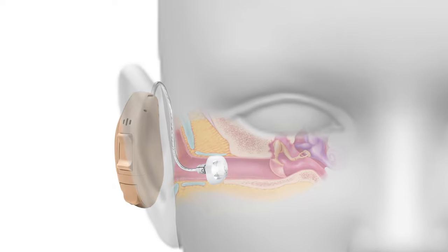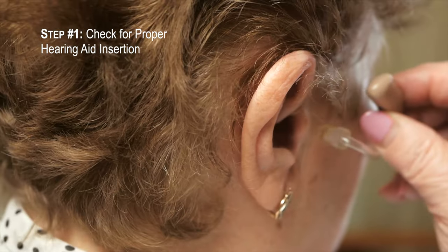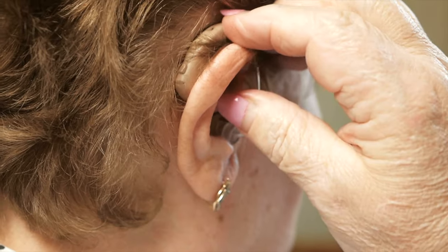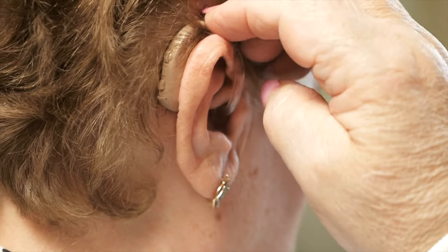Here is a step-by-step way to address feedback when encountered. As the very first step, check to make sure your hearing aids are inserted correctly. You want to minimize any sound leakage that may get picked up by the hearing aid's microphone.